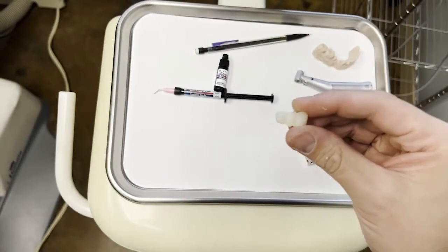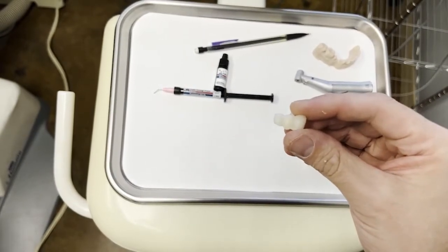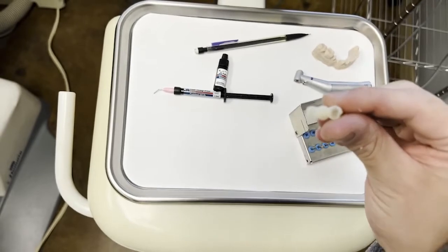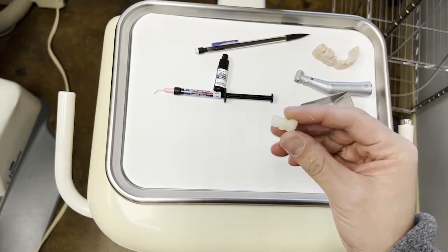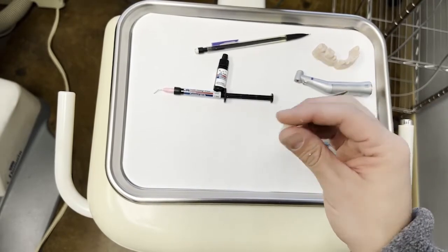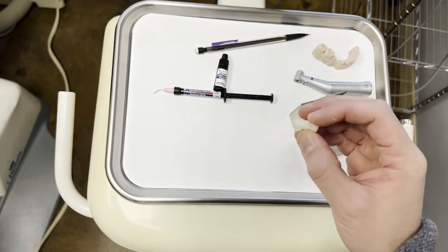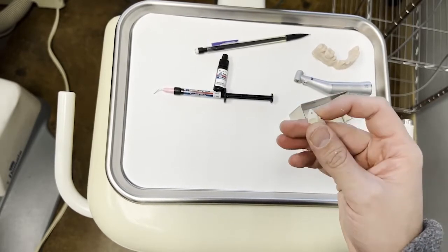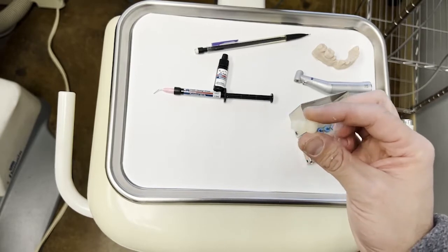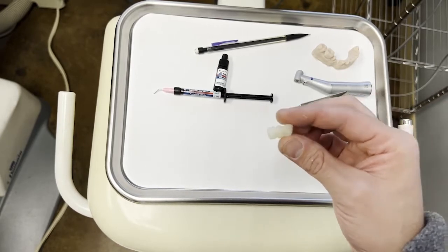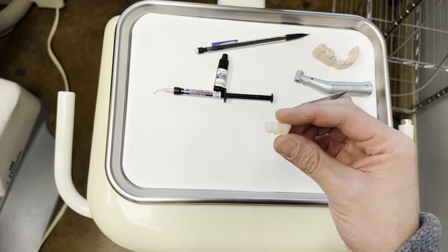So now we've done some more shaping with our diamond burr at around 40,000 RPMs here. And you can see that we're certainly rounding into shape. We still have our interproximal contacts in place on both sides and things are looking pretty good. Now you could probably cement it here and still be pretty good, but we're going to try to take it to the next level.